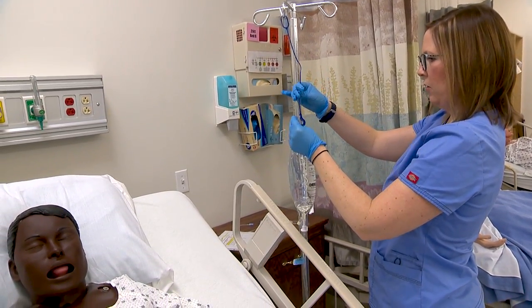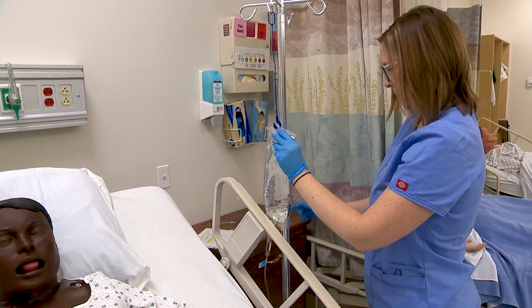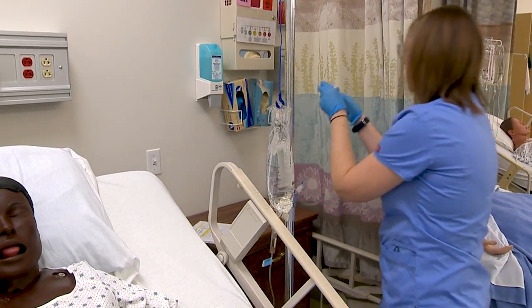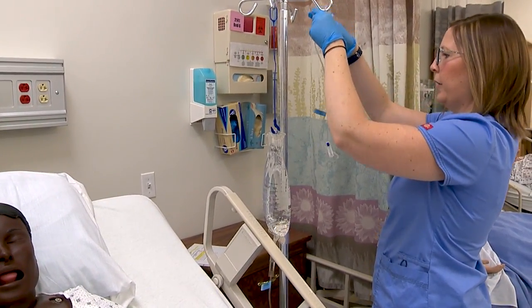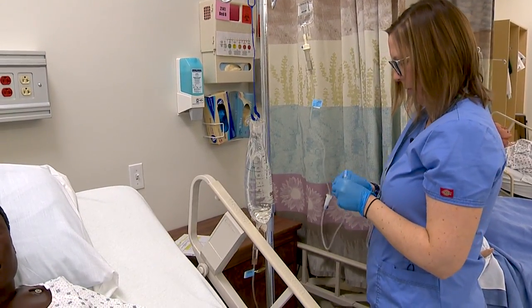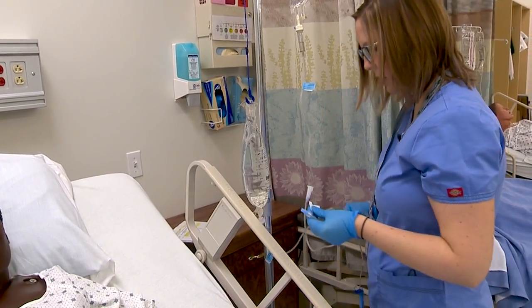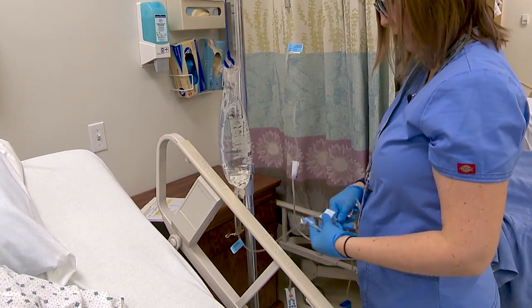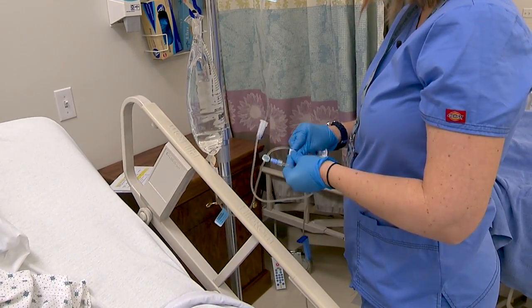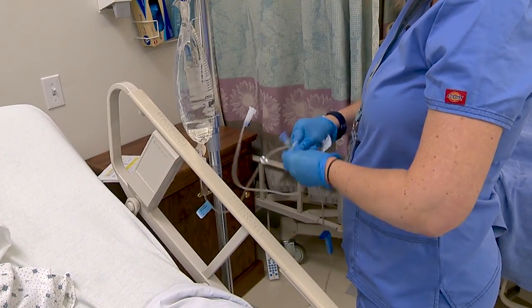We have to drop down our primary fluid. Hang my Cipro here. And again, I'm going to scrub the hub. Now I'm going to connect the secondary to this port here, closest to the primary fluids. So scrub again for 15 seconds.